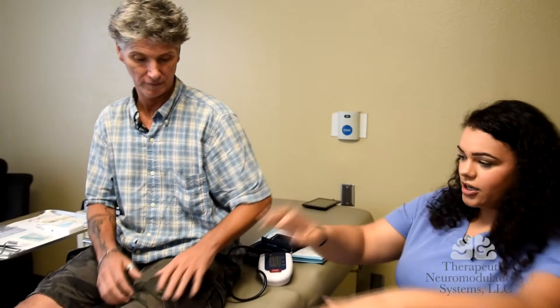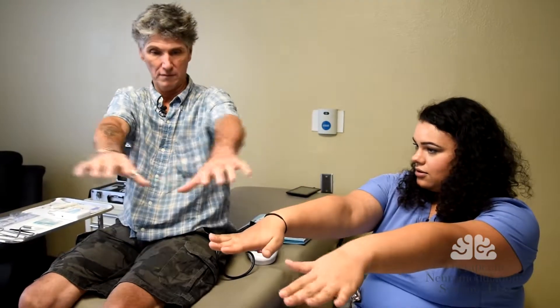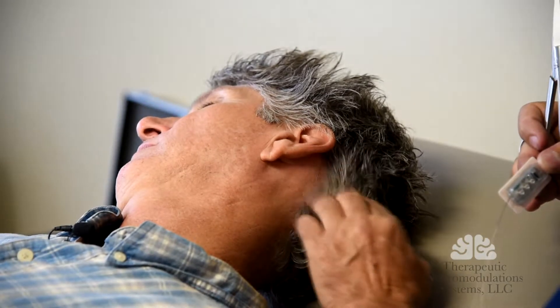Can you hold your hand straight out like this? Straight out. It has been determined that the patient has a COWS score of 14. We will now proceed with application of the Morph device and come back to make another determination of his clinical opiate withdrawal scale.